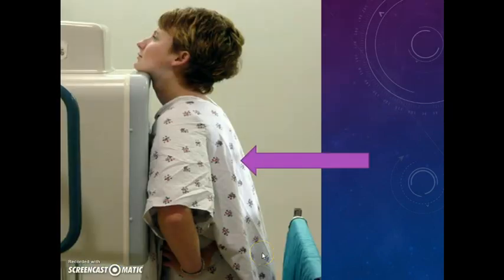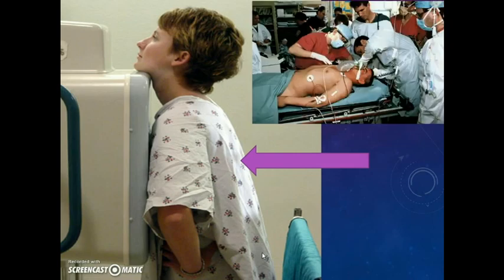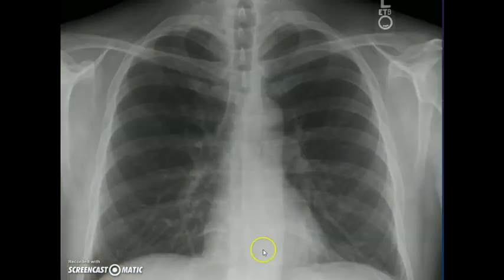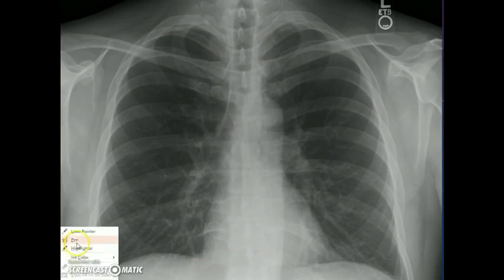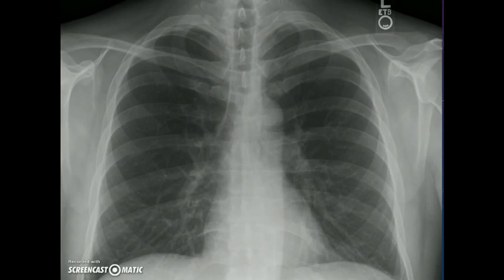This is how a chest X-ray is taken — it is generally a PA view. But in many trauma cases, if the patient cannot be mobilized, we will have to adjust with the AP view. This is the classical chest X-ray PA view. Now when we see an X-ray like this, our eye will tend to go into the pathology first — it is okay. But after the primary survey, go in for the secondary survey.